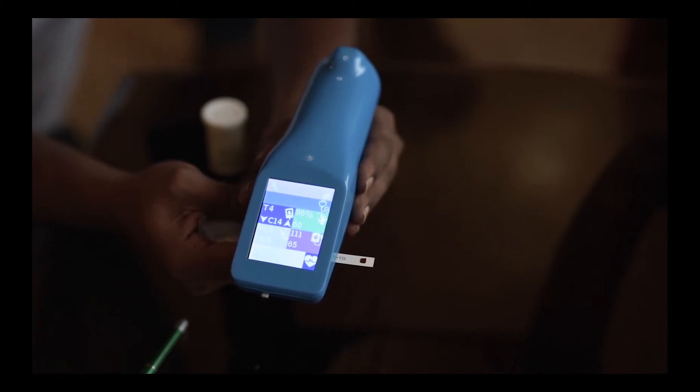Once the 20-second cycle is done, you see the blood glucose reflected on the screen.